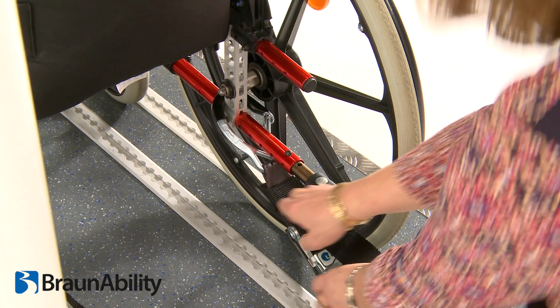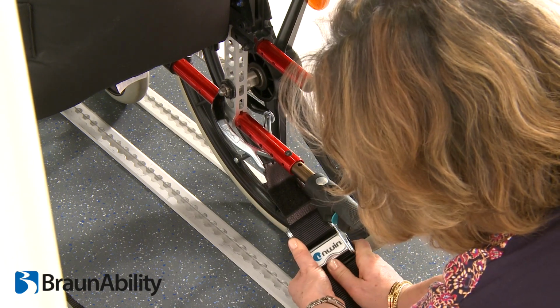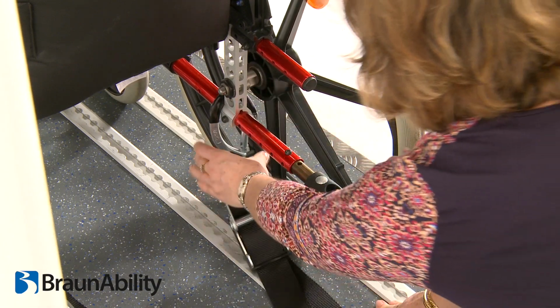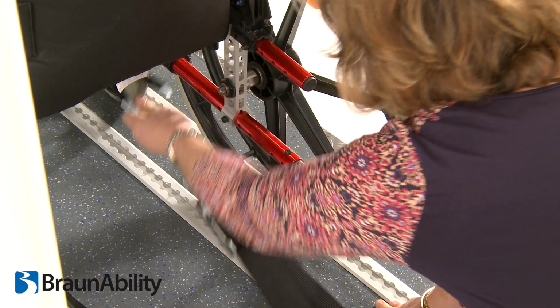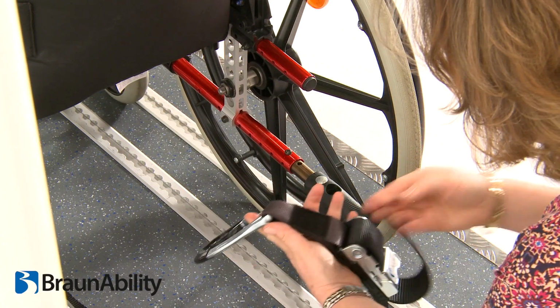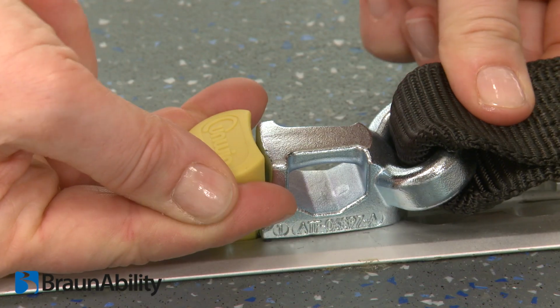To remove the rear wheelchair tie-downs, undo the over-centre tensioners, as shown. Pull the restraints so the webbings are slack and unfasten the carabiners from the wheelchair frame. Close the over-centre tensioners and refasten the Velcro. Remove the ATF feet from the rail.